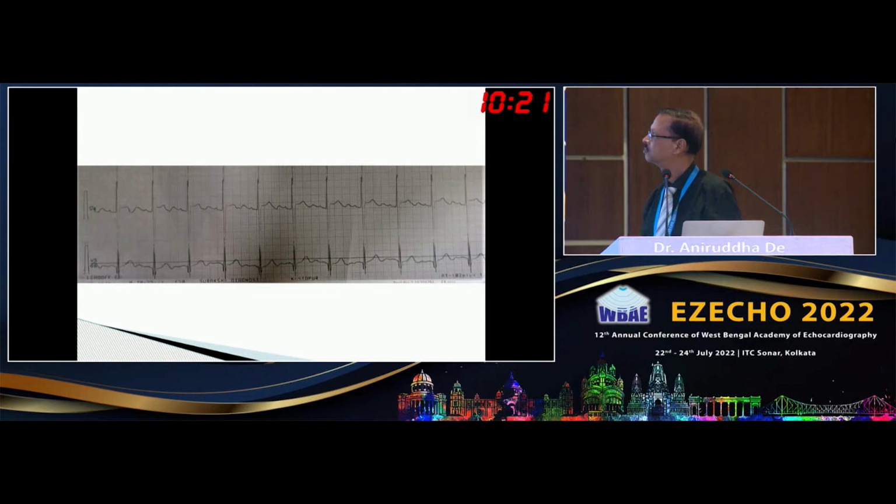Okay. And I think the QRS duration is close to 100. Is it not a double P or something? No, that is a U wave. Positive U wave. The P wave is a little different, and the PR interval is all right. And the QRS is probably 100 milliseconds. That's all I can think of. Okay, forget about it. This is actually my query, nothing else, in the ECG.